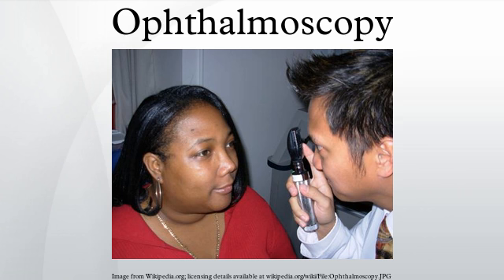While training in France, Andreas Anagnostakis, MD, an ophthalmologist from Greece, came up with the idea of making the instrument handheld by adding a concave mirror. Austin Barnett created a model for Anagnostakis, which he used in his practice and subsequently when presented at the first ophthalmological conference in Brussels in 1857, the instrument became very popular among ophthalmologists.